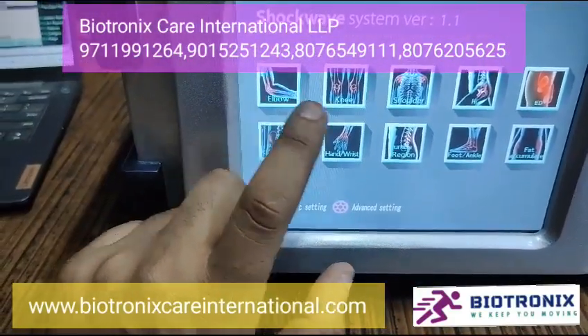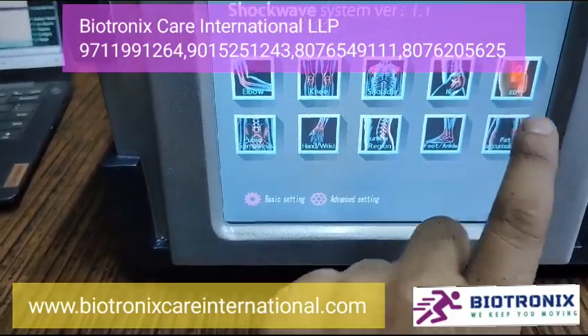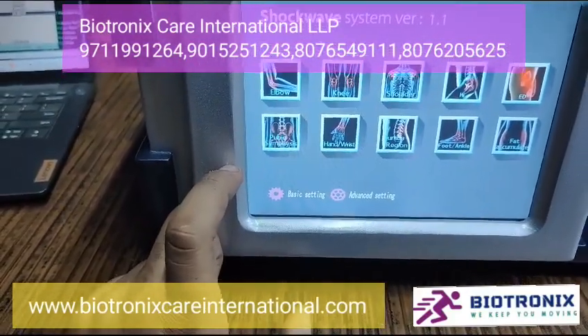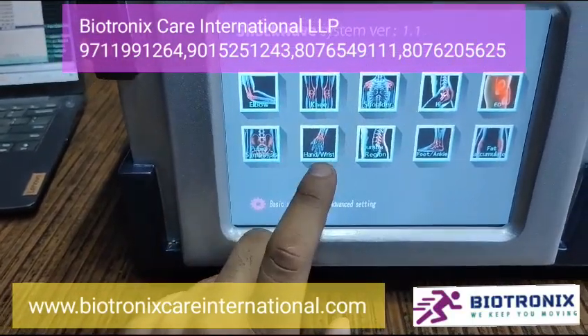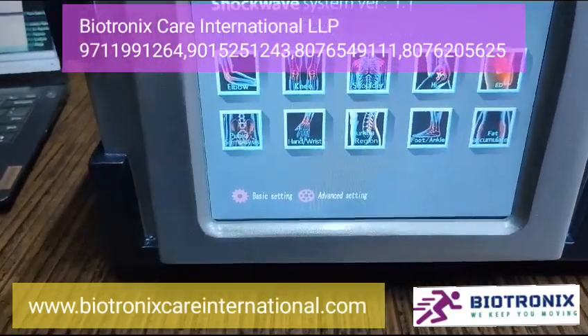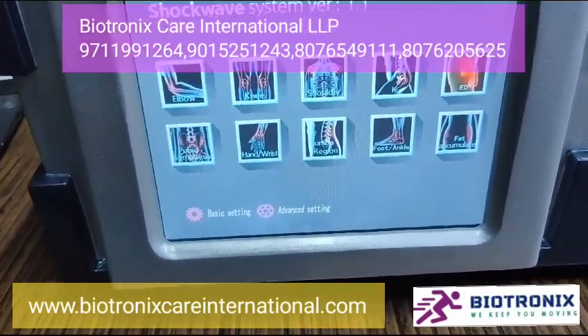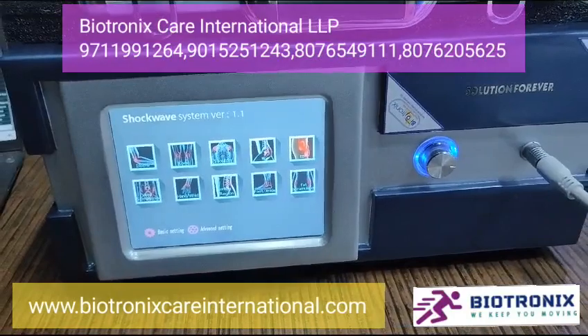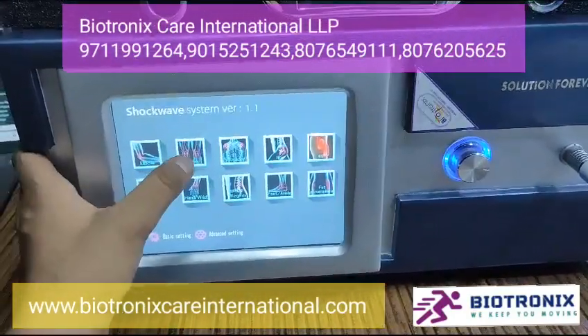On the main screen you will get the following functions: elbow, knee, shoulder, hip, ED, pubic symphysis, hand, wrist, lumbar region, foot, and fat accumulation. For basic operation you can select any of these parameters.